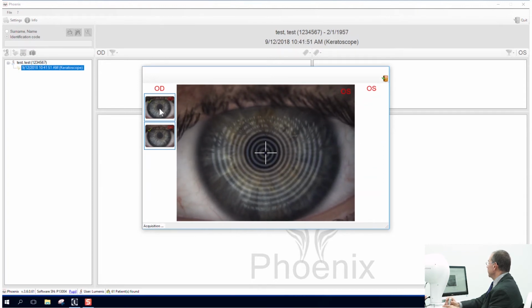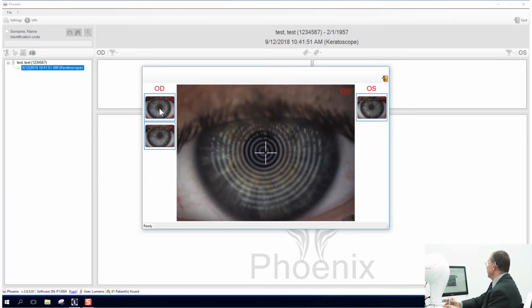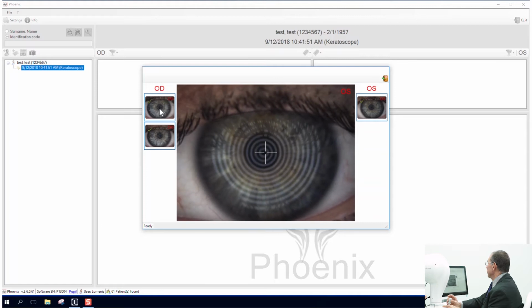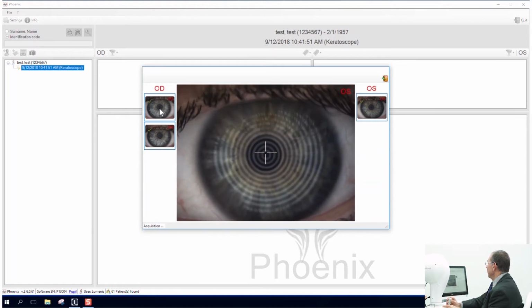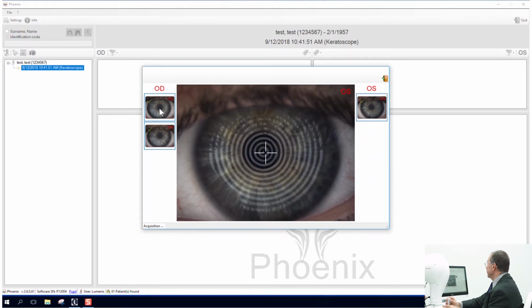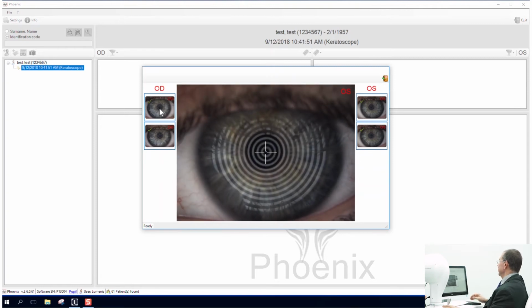You'll notice that I talk to the patient, that's great, keep it up, that's perfect. And we're going to do another one to allow the patient to blink before we do it. And we're going to click and keep your eyes open wide. That's great, you're doing fantastic, excellent.